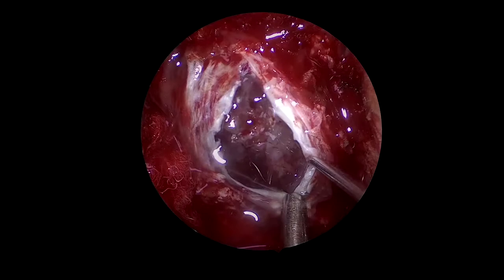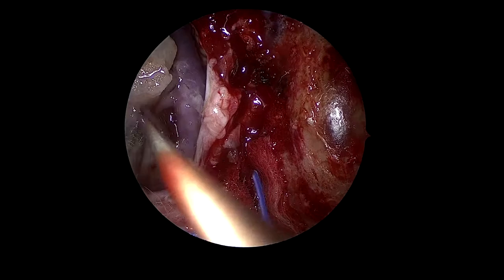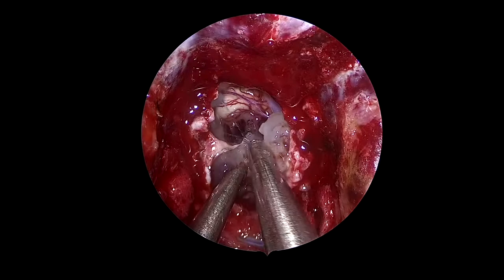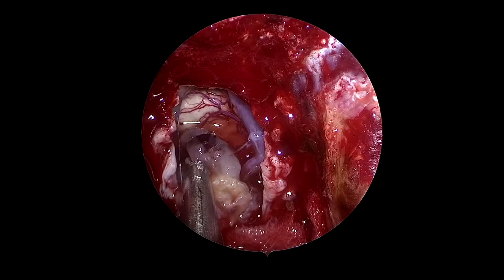The basilar artery can be appreciated to the left of the tumor, and we proceed with careful microdissection of the tumor away from the basilar. We can see the origin of the anterior inferior cerebellar artery. The tumor is quite solid and it's not suckable, so we have to remove it in a piecemeal fashion until it becomes smaller.